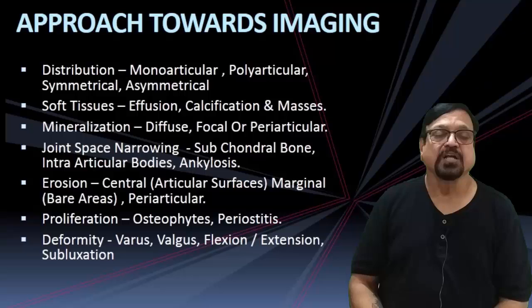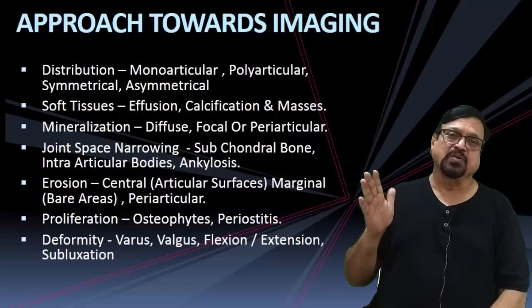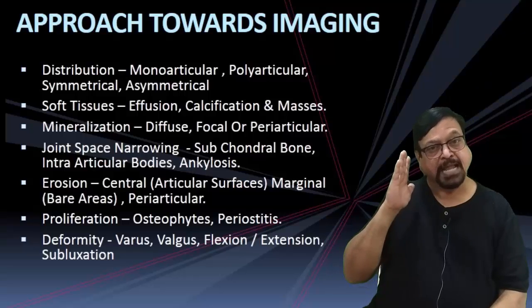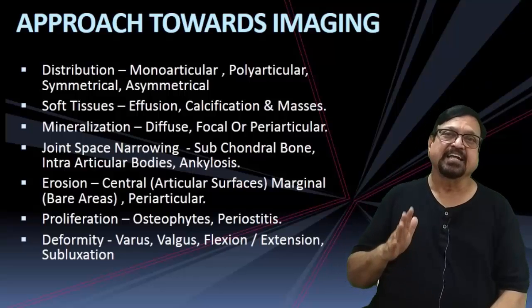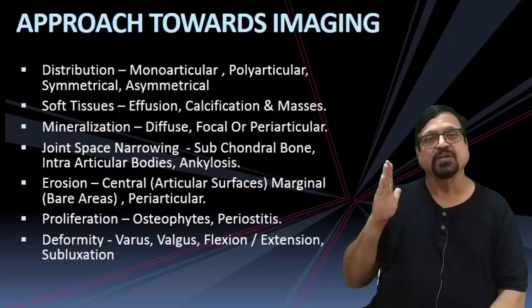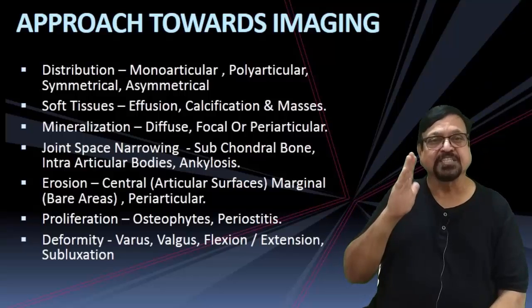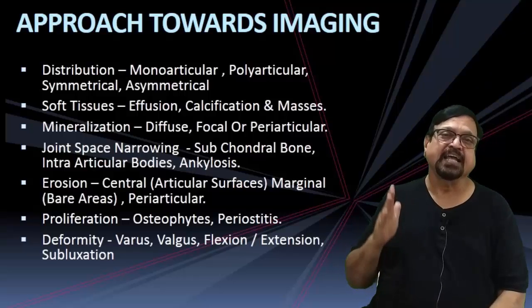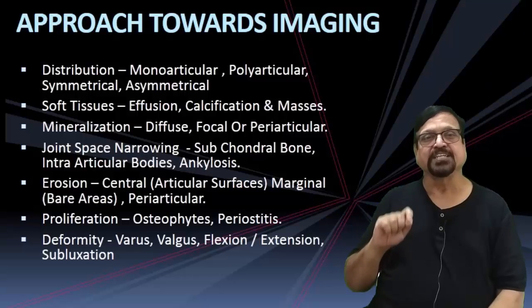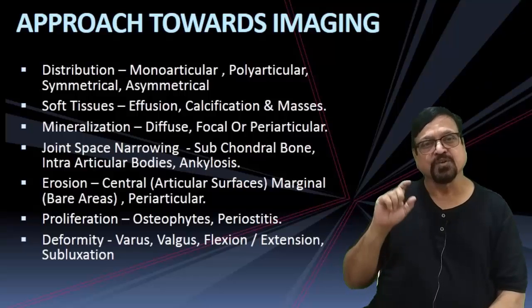Imaging approach. For any patient coming to you with tubercular arthritis, we have seen the background and how the patient is investigated. Now, what does a radiologist need for interpretation of tubercular arthritis? History has to be taken by a radiologist or radiology assistant, since it gives essential features for the diagnosis of tuberculosis.